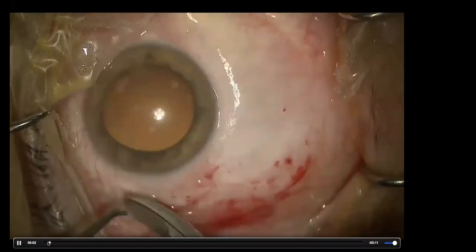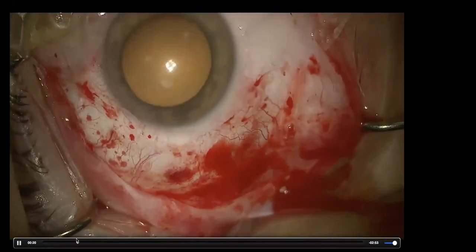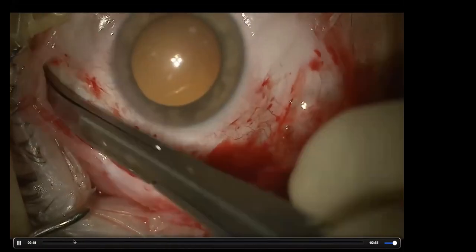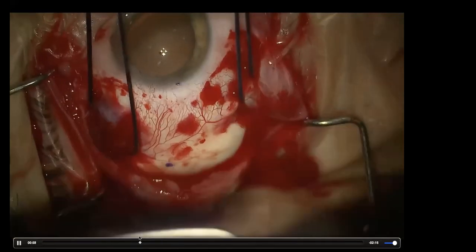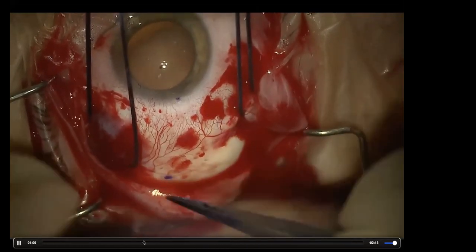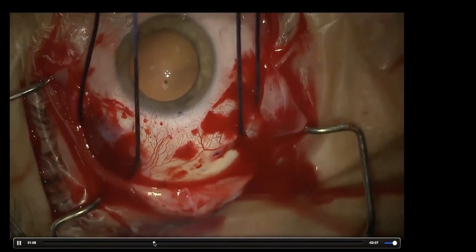So here I do all the surgeries in local anesthesia subtenon because I don't want to perforate. General anesthesia is not necessary. I open the conjunctiva in the inferotemporal and supranasal quadrant, and I isolate the muscle. So here I measure the correct distance from the limbus. It's in between the two muscles.